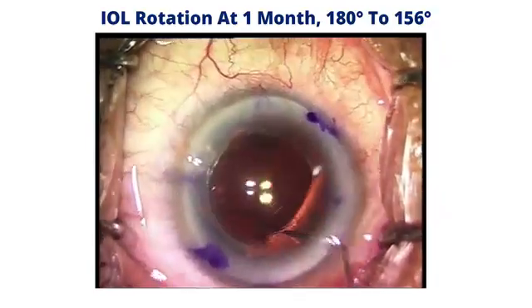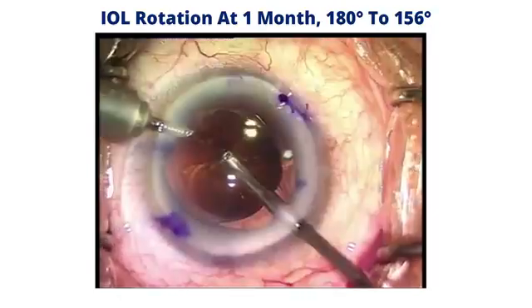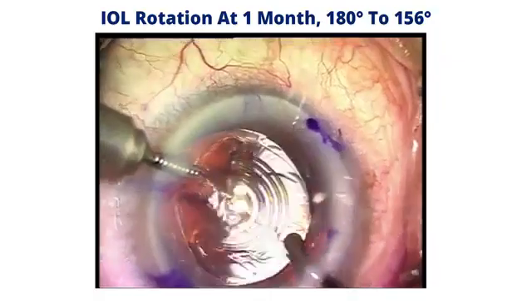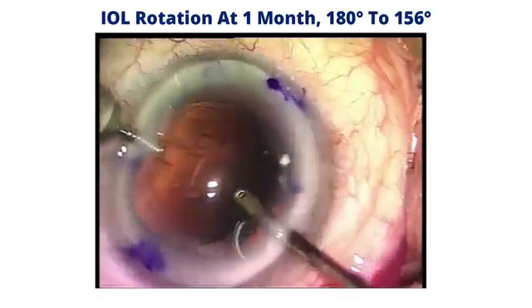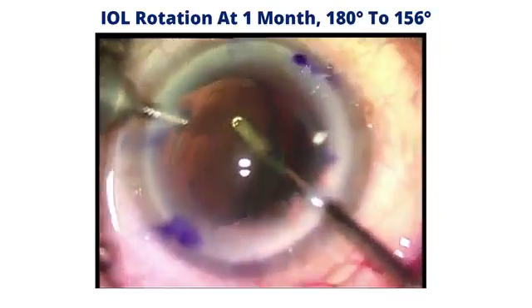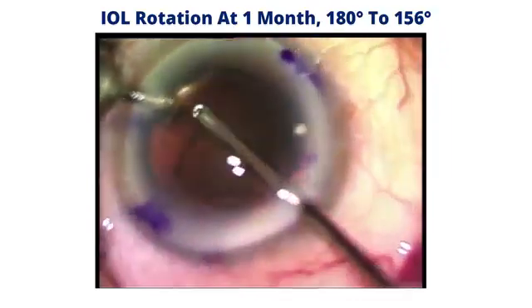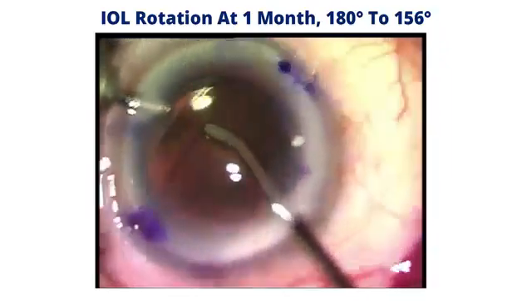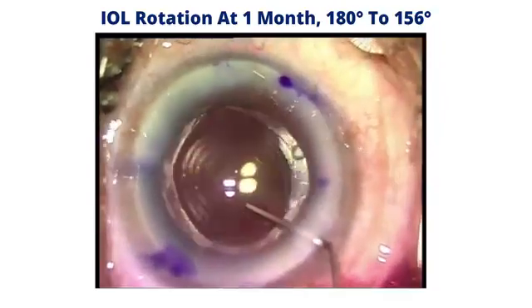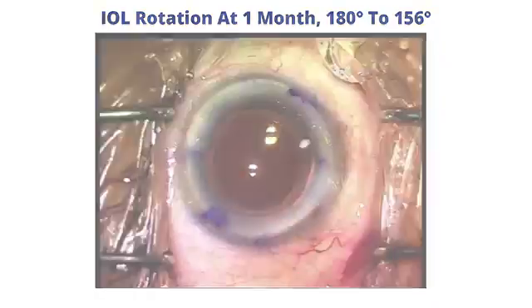So it leaves me now just to rotate the lens to the correct position and then remove the viscoelastic, and you can see this lens is already just short of that 156 degrees that I intend to rotate it to. I'm now removing the viscoelastic and then finally adjusting the lens to the desired position. And once it's in alignment, I'm happy. I seal the incisions and then make sure that it is not overinflated, and I tap it into position.